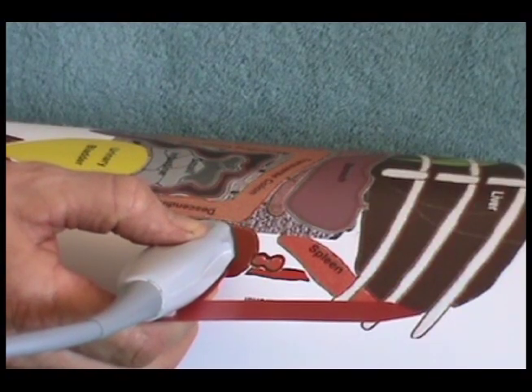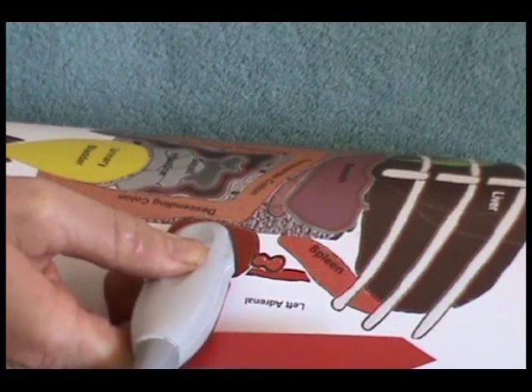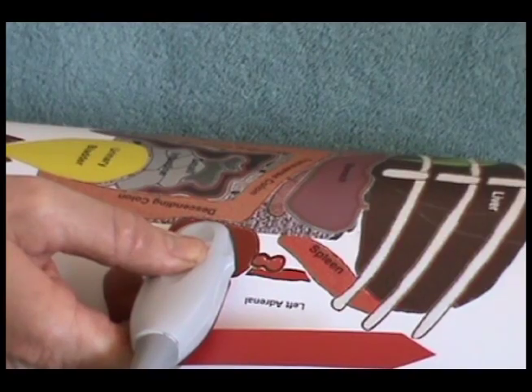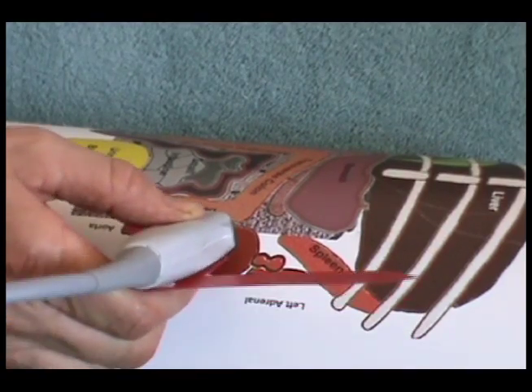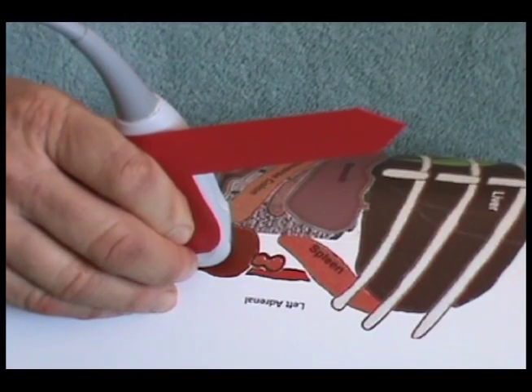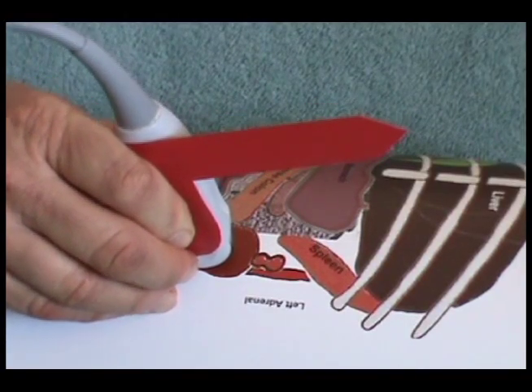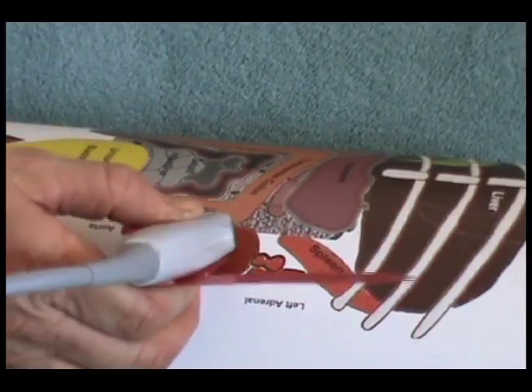Fan the transducer ventrally till the transducer is no longer pointing at the kidney. Then reverse direction and fan dorsally till the transducer is no longer pointing at the kidney. Return to the initial position bisecting the kidney.